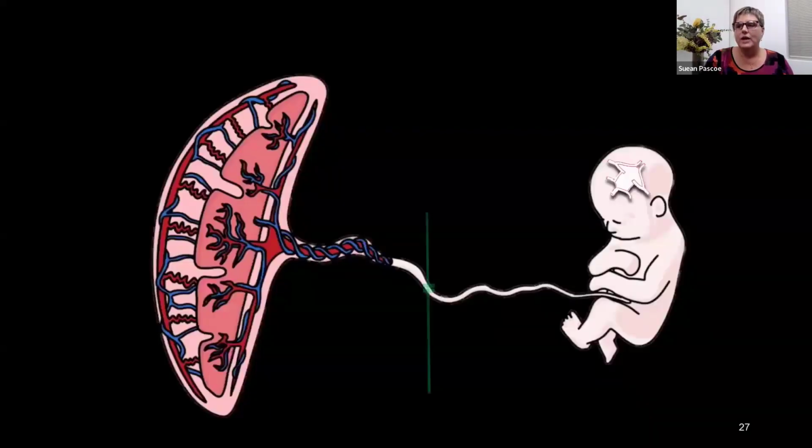And so when we look at the umbilical artery Doppler, if we were to measure the resistance to flow, it should be low, because the baby, as a parasite, definitely needs forward blood flow in order to grow and thrive. If there is a restriction to blood flow, it will stop thriving. And so baby needs continuous forward blood flow through all stages of that cardiac cycle, so in systole and in diastole, it needs blood flow all the time to keep growing healthily.